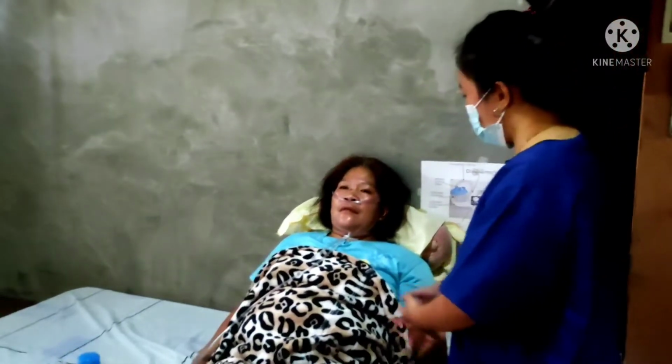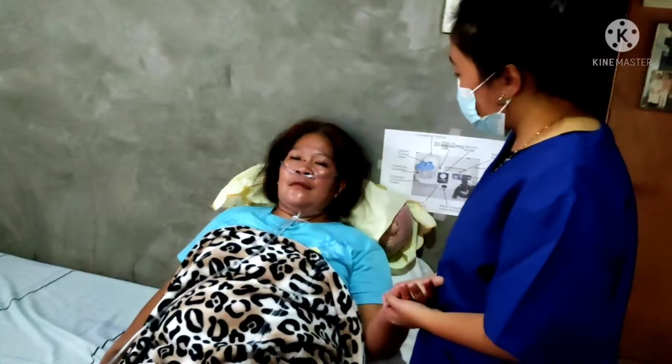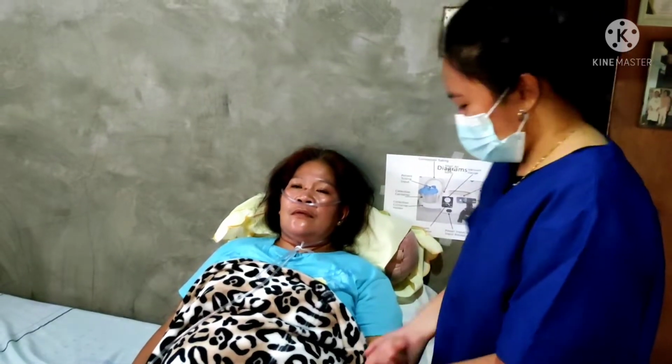Hi ma'am, my name is Gigilan Velasco from Sasn, Quezon City. So I'm your student caregiver for today. So ma'am, can I check your wristband? And state your name and when is your birthday? My name is Geraldine Velasco. And when is your birthday? March 17, 1972. Okay, thank you. So ma'am, I'm performing oropharyngeal suctioning. Is that okay with you?